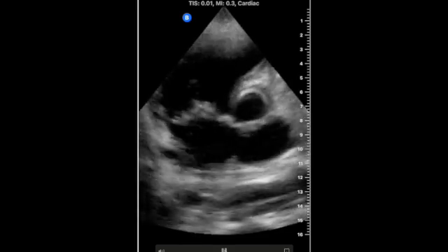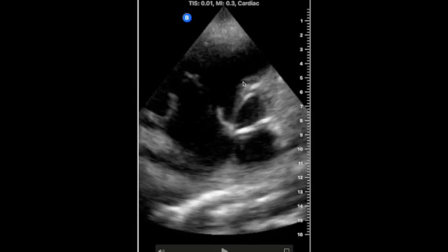And the cause of that is generally, obviously, over time, because if this was that acute a process, the chances that you would have a right ventricular free wall rupture are pretty high. But you can have a PE. It could be a submassive pulmonary embolism, where all of a sudden we're seeing these pressures. The right ventricle is not hypertrophied. There was probably not a significant amount of time for the heart to adjust to these pressures, which is probably an acute or an acute on chronic process.